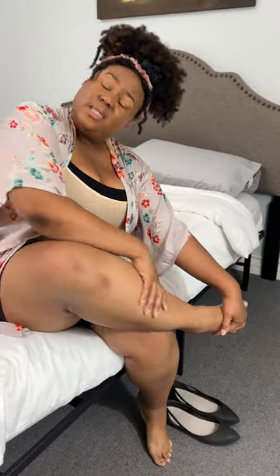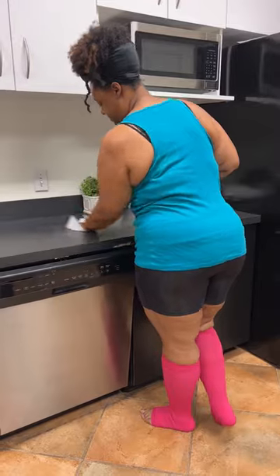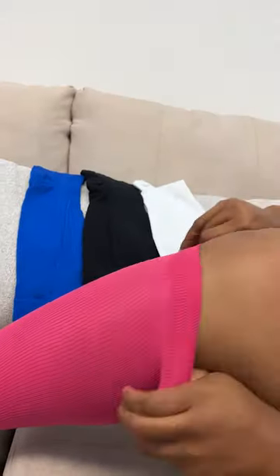This is perfect for people who for various reasons struggle with swelling of their legs and people who are on their feet a lot during the day. These are 20 to 30 mmHg, which is a measurement of the compression level.